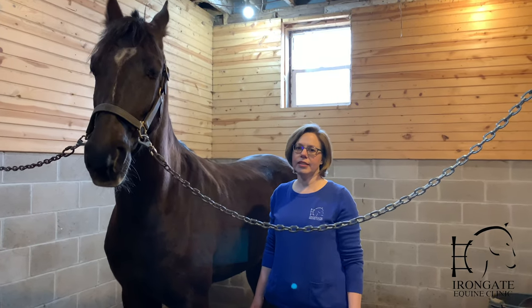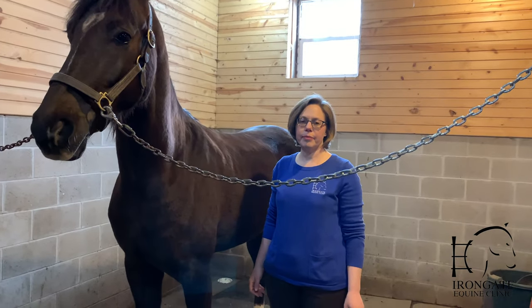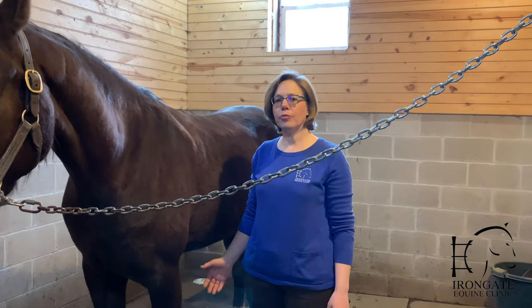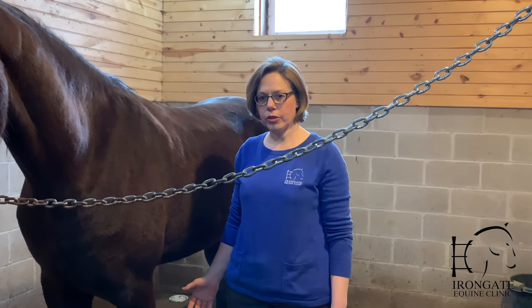Hello, my name is Dr. Lisa Nesson. I'm with Iron Gate Equine Clinic in Madison, Wisconsin. And today I want to show you how to bandage a wound on the lower limb of a horse.